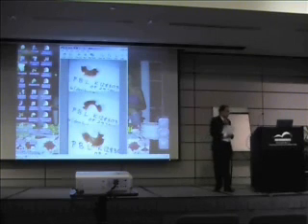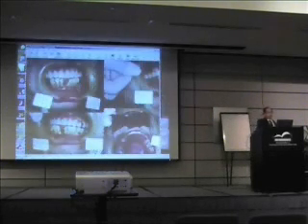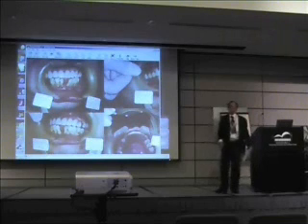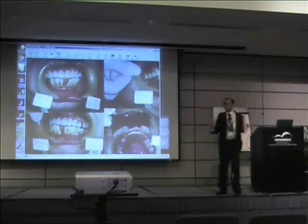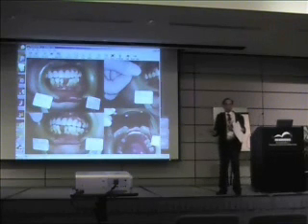We put that into the patient's mouth. It sits well and it doesn't come down. It's more than 2 years in the mouth already, or close to 2 years. She still comes to me for treatment, for checkup, and I didn't have to change the soft liner at all. The soft liner can work. So this is another option you have in your hands for you to do.